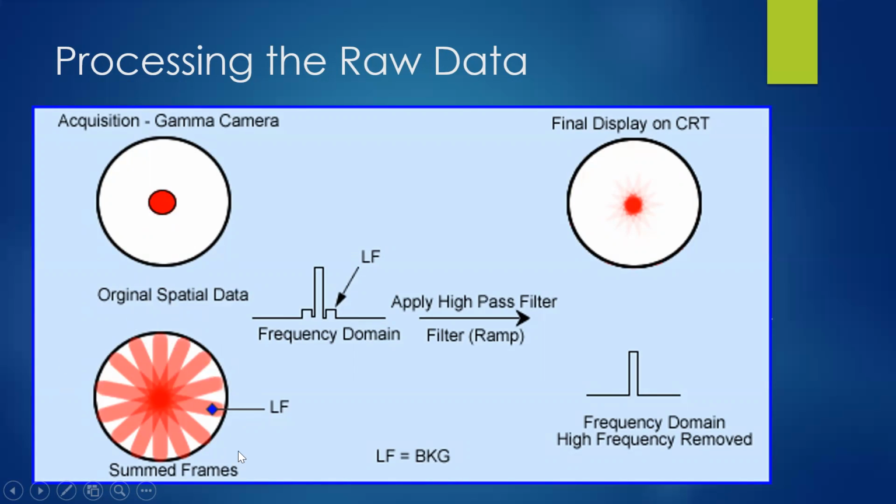Right? And I go all the way around that hot spot. Look what I end up getting. I end up getting something that looks like this. Look at some of the arrays. As you get closer to the center, you get more and more activity, and in the center of that activity is the hottest amount.